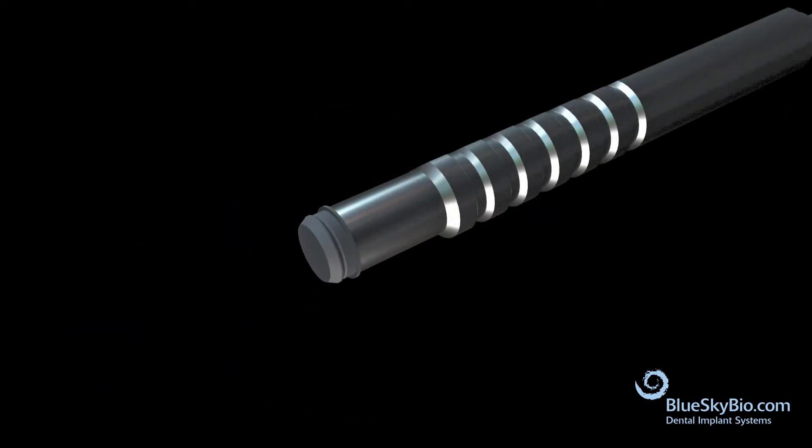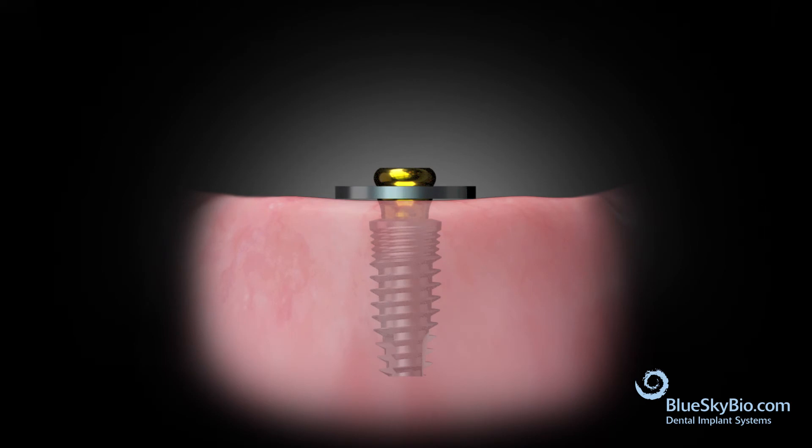Use an insertion tool to place the black processing insert into the metal housing. Place a block out ring over the abutment followed by the retentive housing.